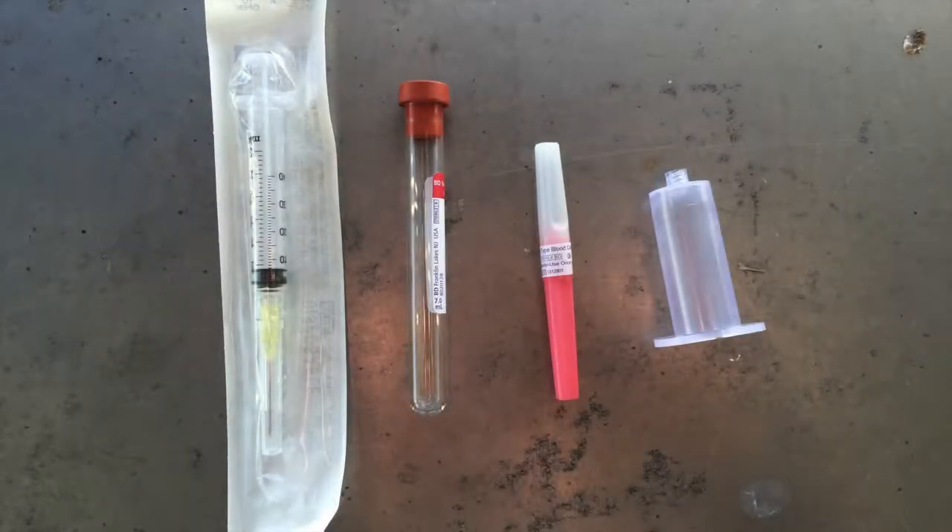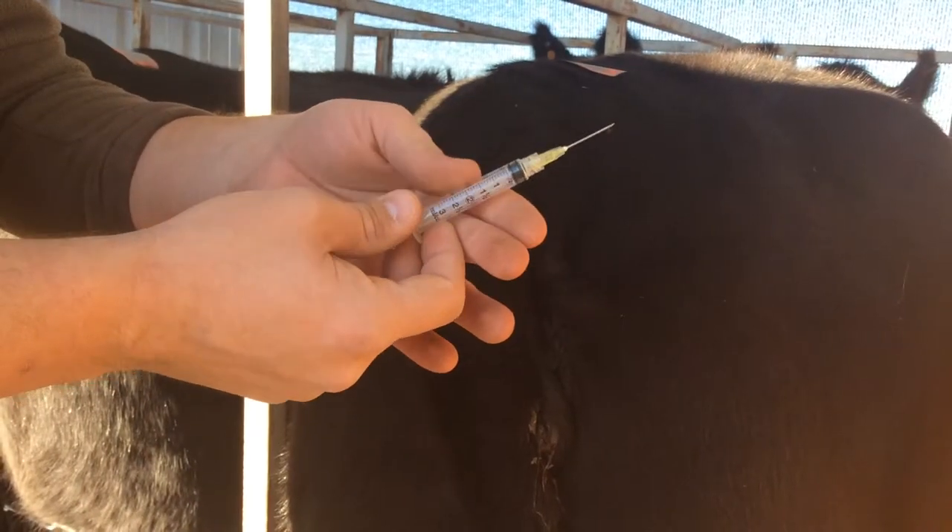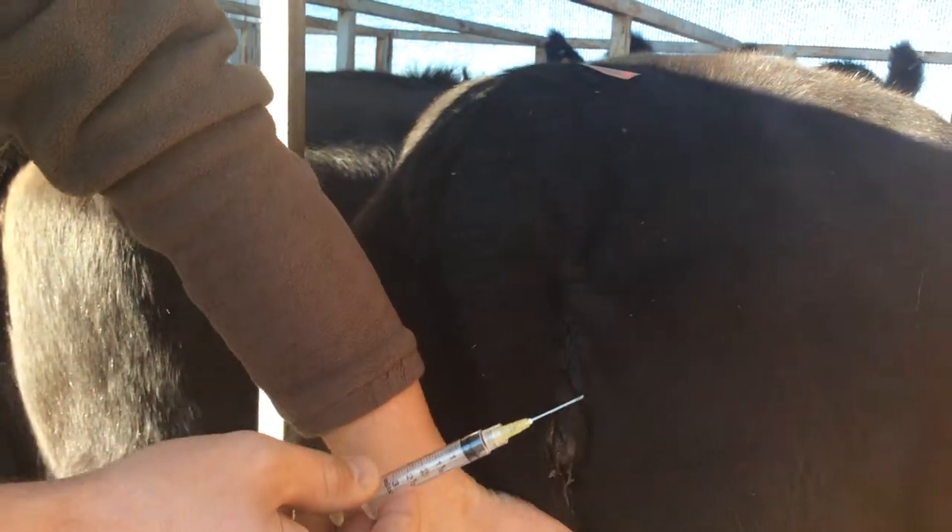This image shows some supplies that are useful in collecting blood from the tail vein of a cow. Make sure that the animal is adequately restrained and that the underside of the tail is clean.